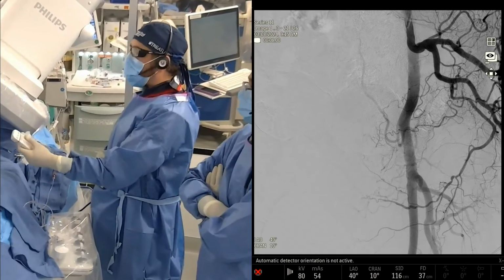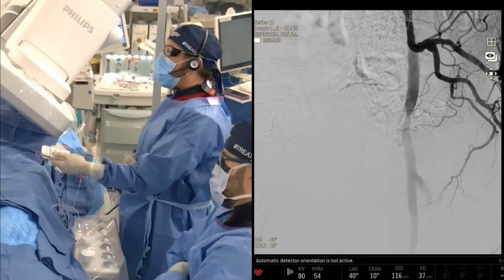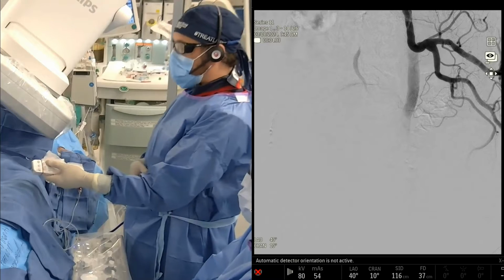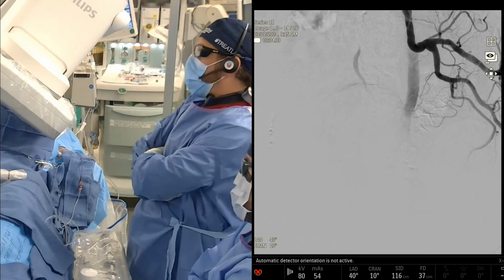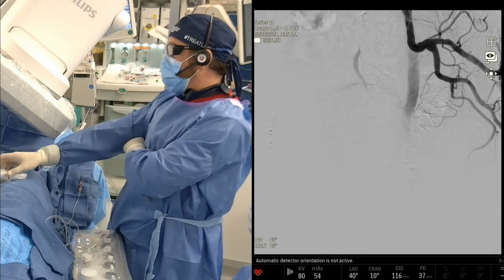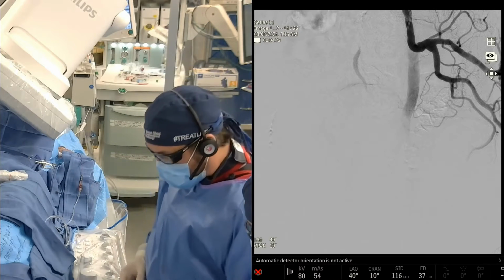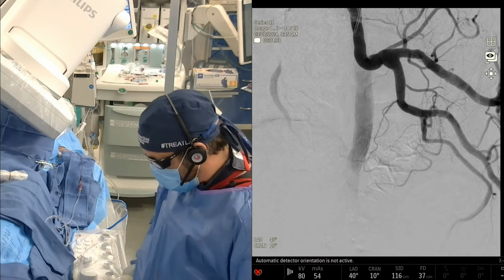So this is interesting. What do you guys think of this angiogram? I'm going to go back to this image here. The first thing that we notice, and we knew this from the CTA, which is another reason why the CTA is so valuable, is that we have no obturator artery here. Given that that's the case, it makes it a lot easier to visualize the anatomy. Puneet was showing me before how to do this. I'm going to pull up processing, zoom in here, and start drawing on the screen.